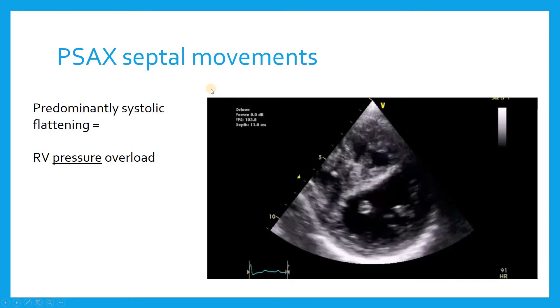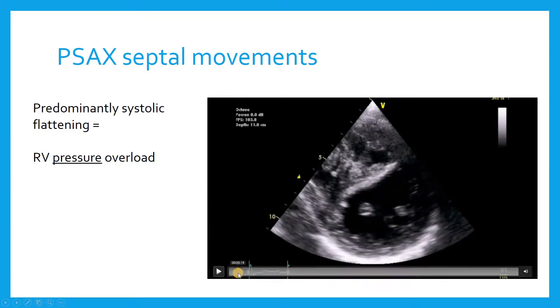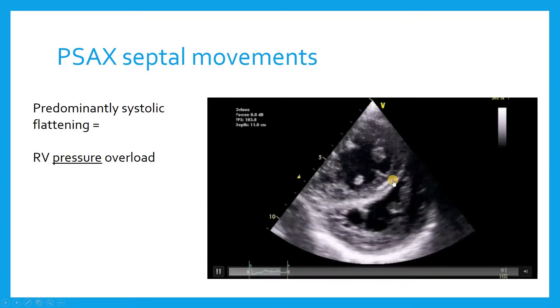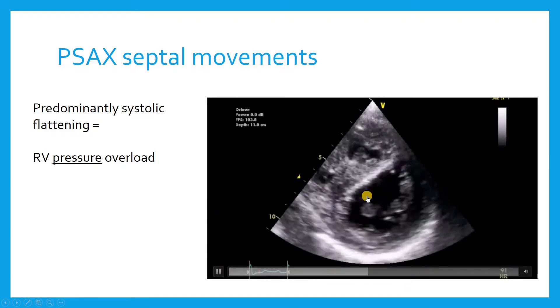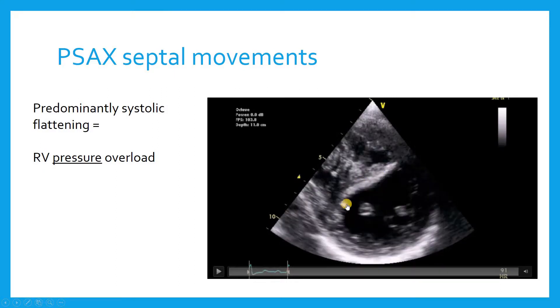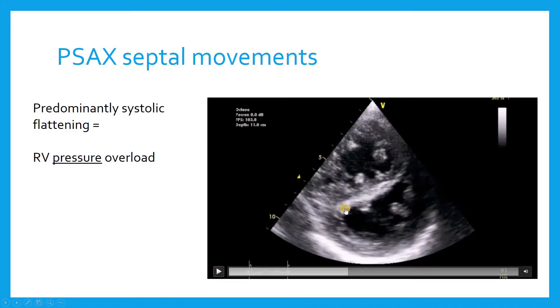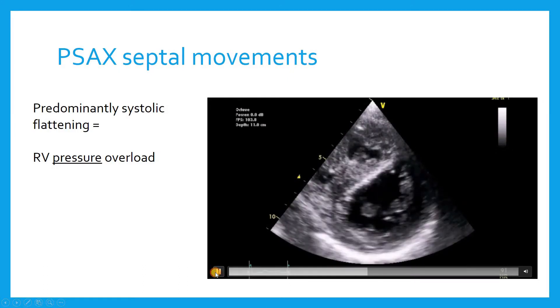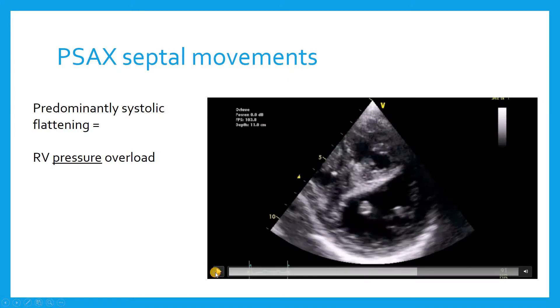This is from a parasternal short axis view. We are looking at more significant flattening during systole in this patient. There is some flattening during diastole as well, seen at the end of the clip — this is still a little bit of a D-shaped left ventricle or flattened septum. But clearly there is very significant flattening during systole, which is really more of a right ventricular pressure overload phenomenon.